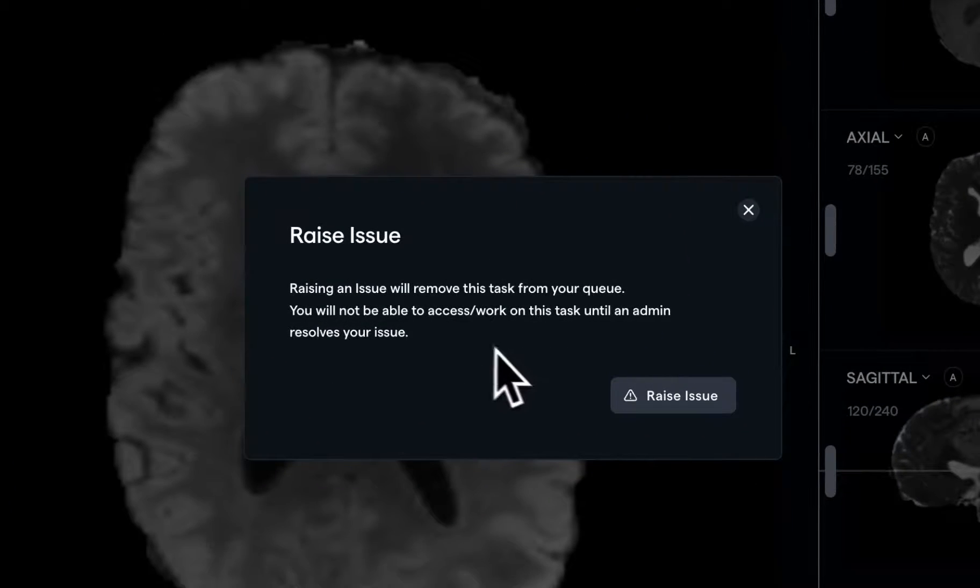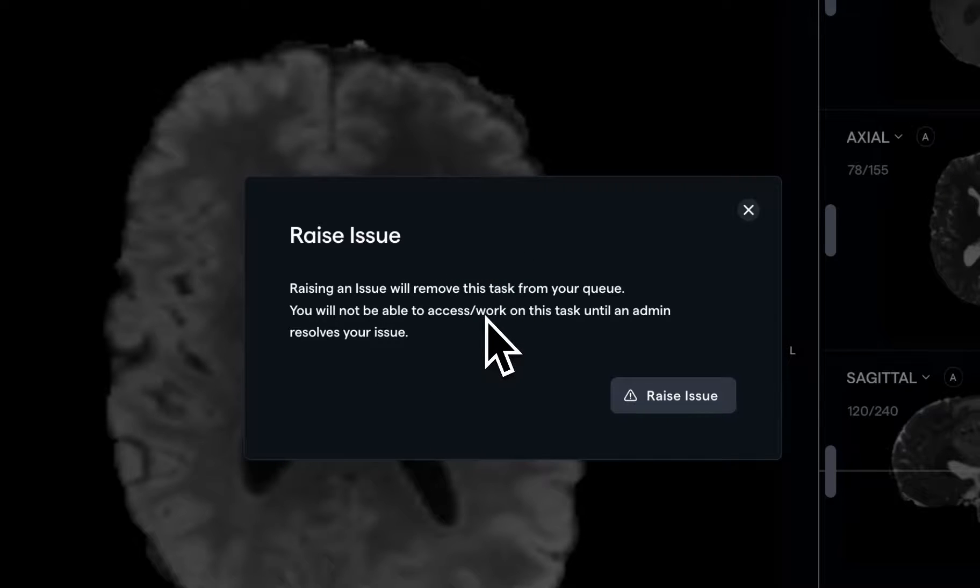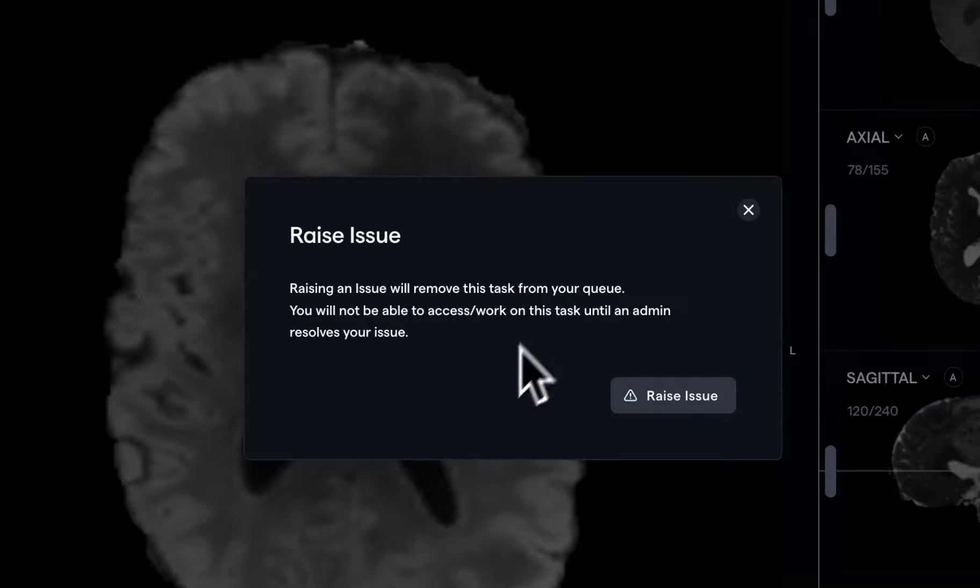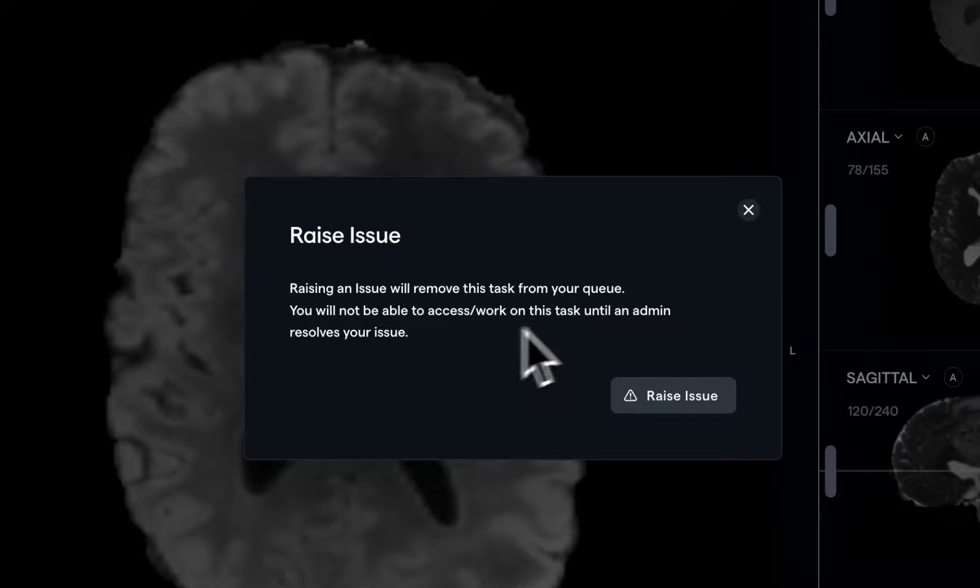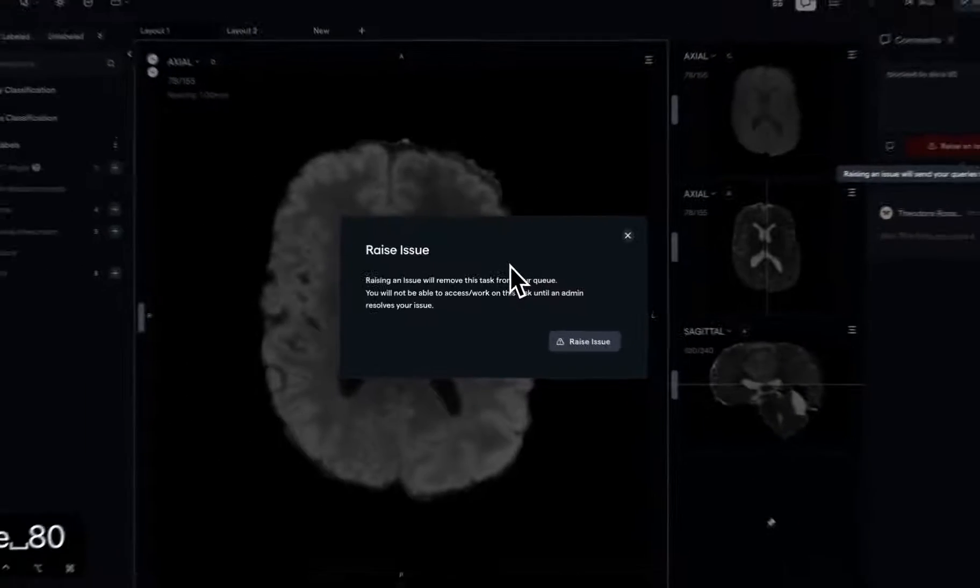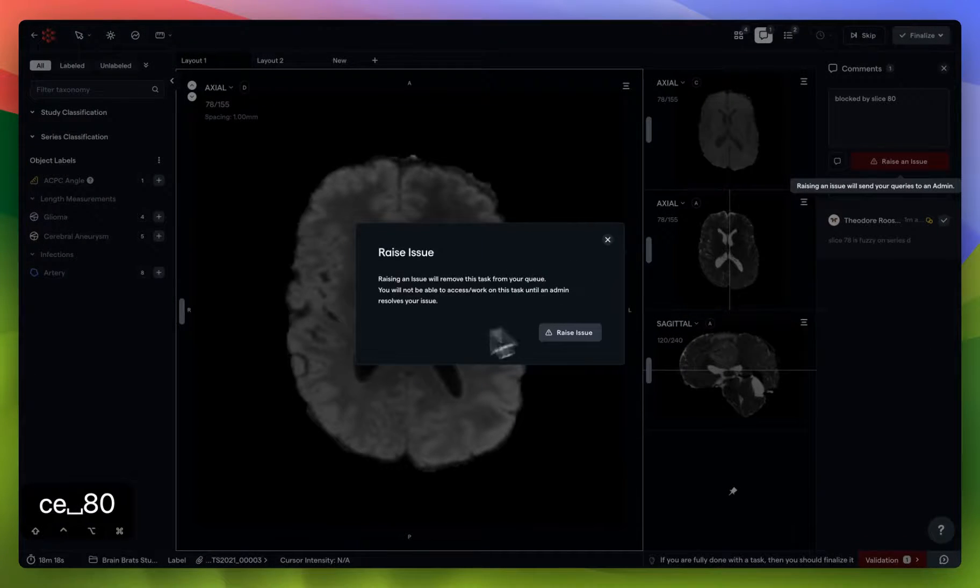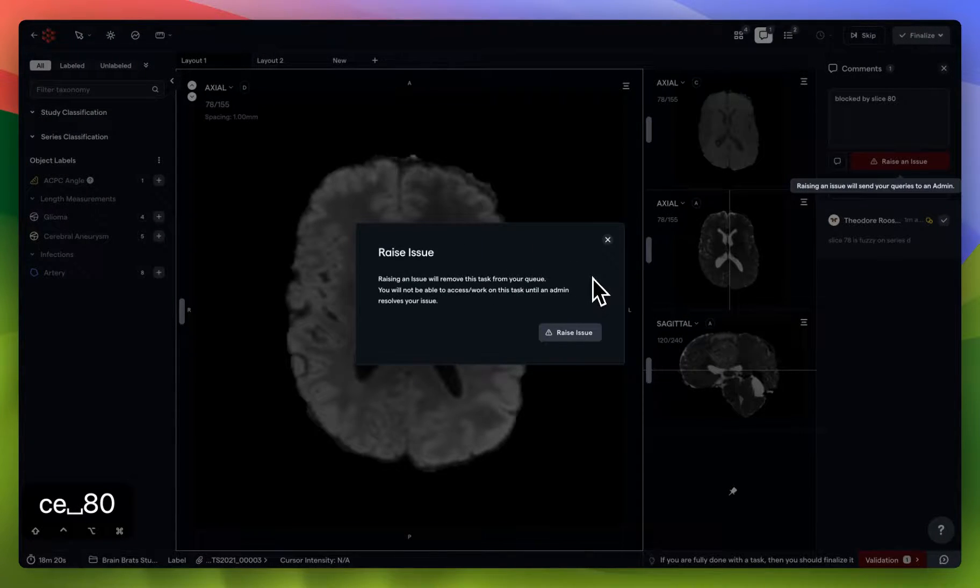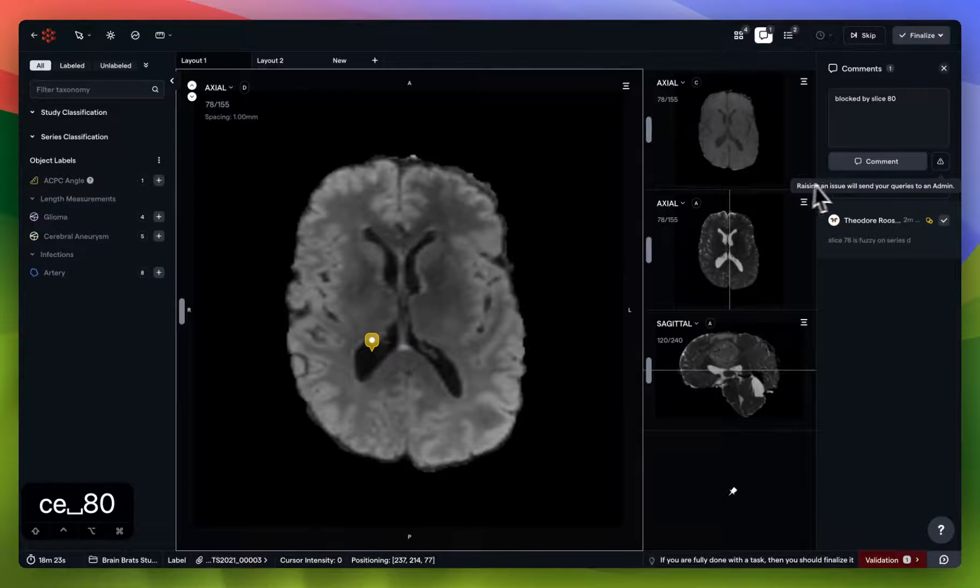As this warning shows you, raising an issue on a task will remove this from your queue, and then you'll be able to continue work on something else, whatever's next up in your queue. Whenever an admin responds to your query and sends it back to you, then you'll be able to continue work on this specific task. So we're going to click X on this for now, because that's not what we want to do.